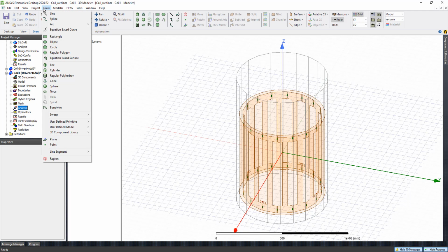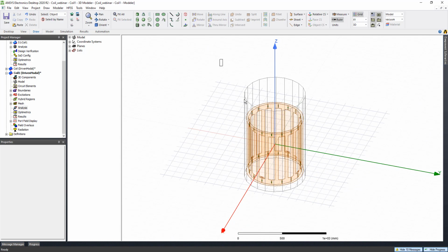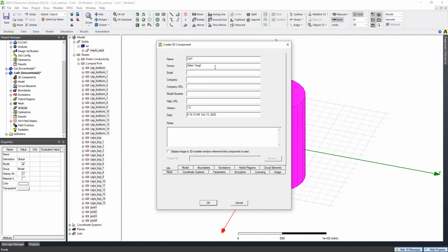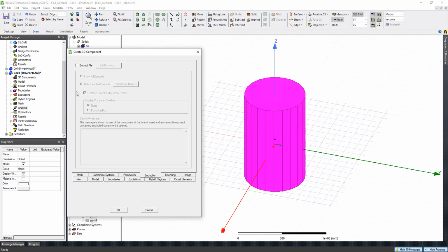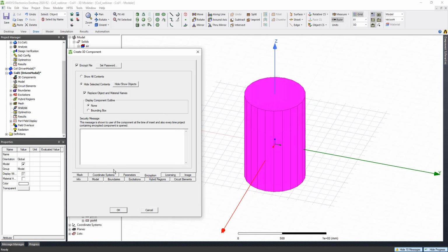So now we go to Draw, 3D component library, create 3D components. Oh yeah, I need to select them. Select everything. Draw, and create 3D component, right? So yeah, Yifan Yang, this is me. And then you can put down your information here. Once your design is created as a 3D component, you can lock it and it will become an encrypted model, so other people cannot look at what is inside it. So here you can encrypt your model, but I'm not going to do that.